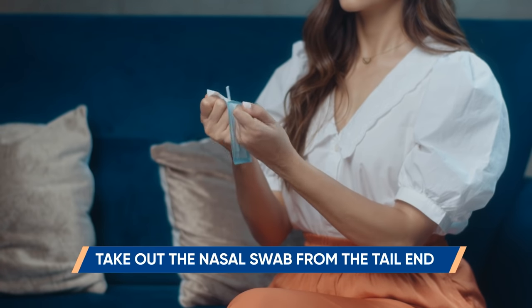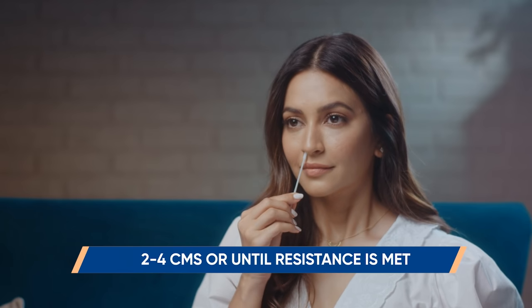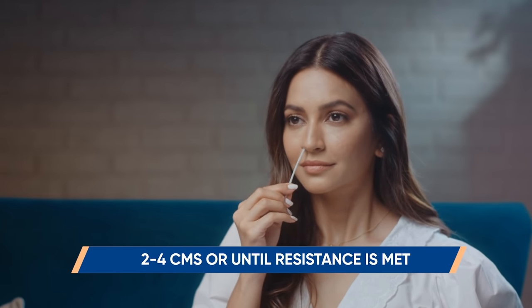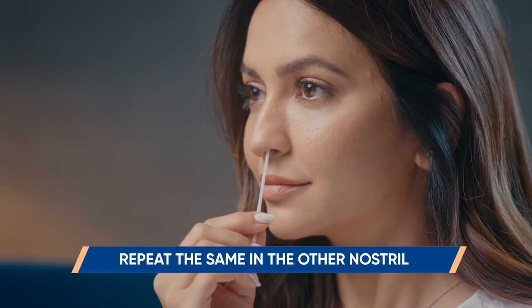Take out the sterile nasal swab from the tail end. Carefully insert the sterile nasal swab in one nostril, 2–4 cm or until resistance is met. Roll the swab 5 times along the inside of your nasal passage. Using the same swab, repeat in the other nostril.